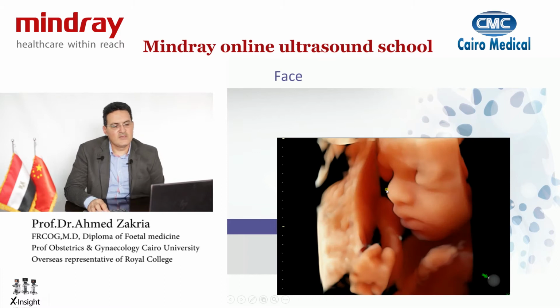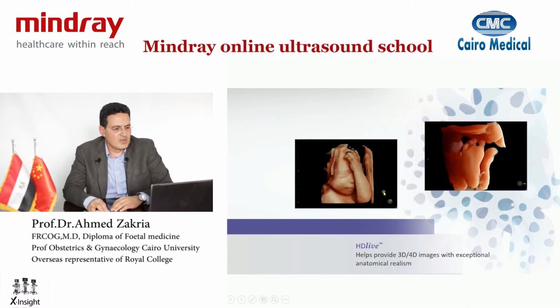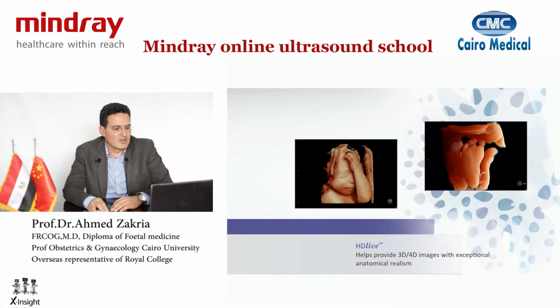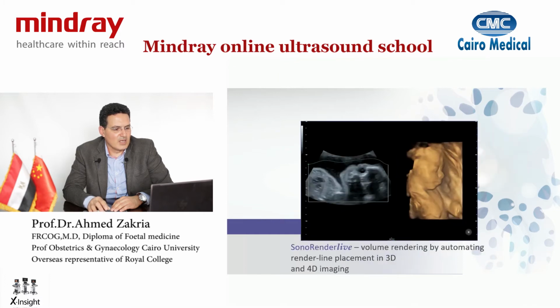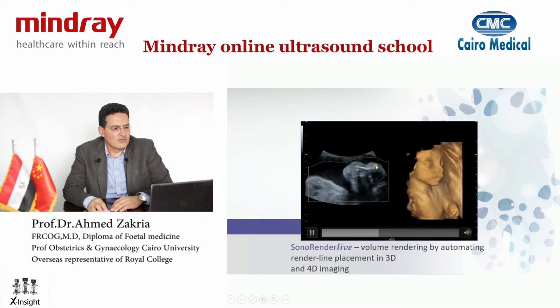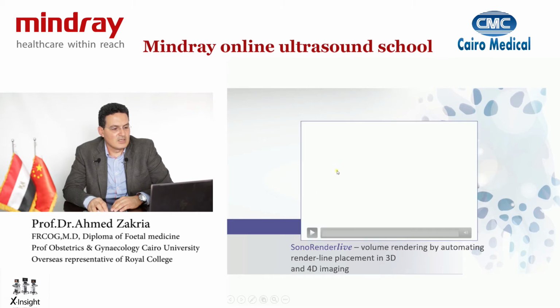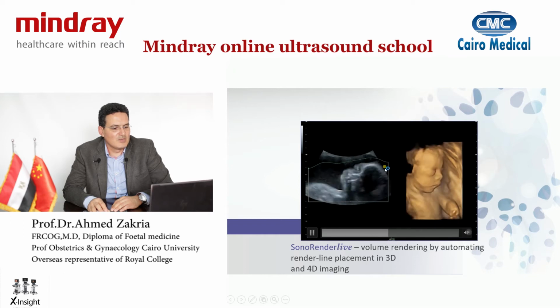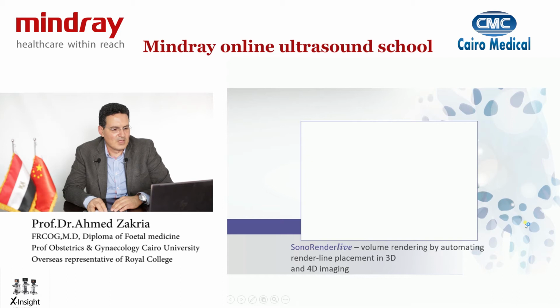What about the fetal face? Well, we have two nice new advances. One of them is obviously the realistic visualization of the face, where, as you can see in the technologies available there, it's very close to reality. And again, what we have is a flexible line of 3D that is there all the time, so it moves as the baby moves, so you can keep the image going in a very realistic way. That's quite nice for the parents, as you all know.